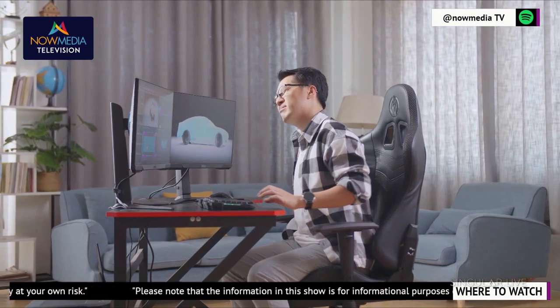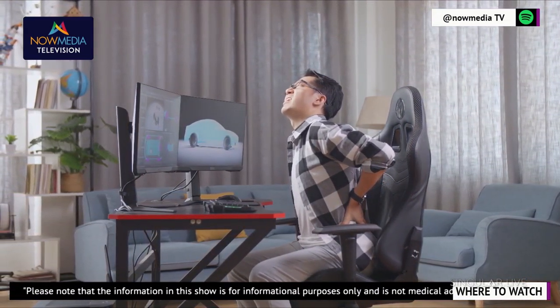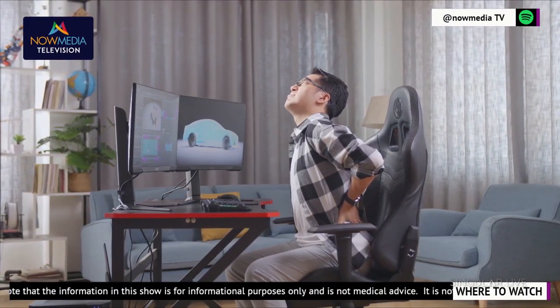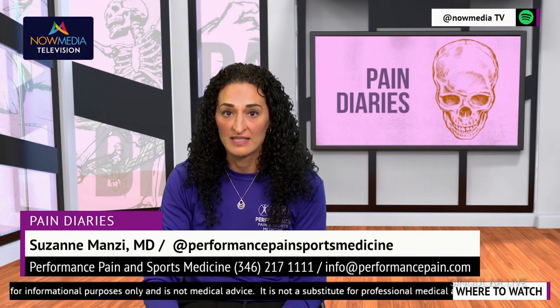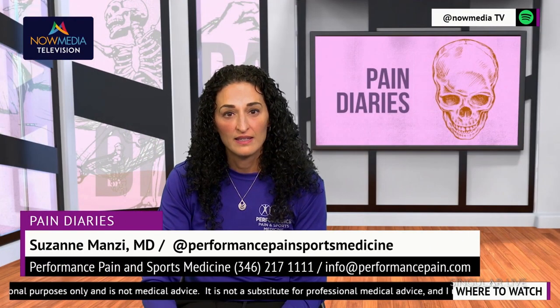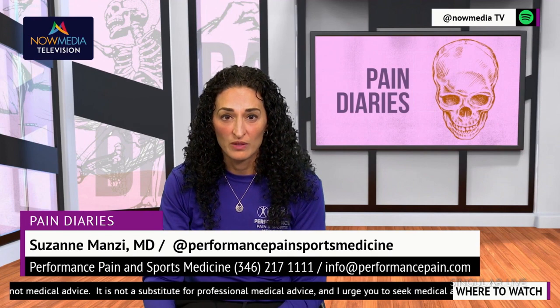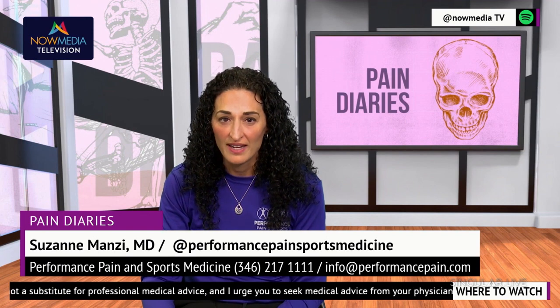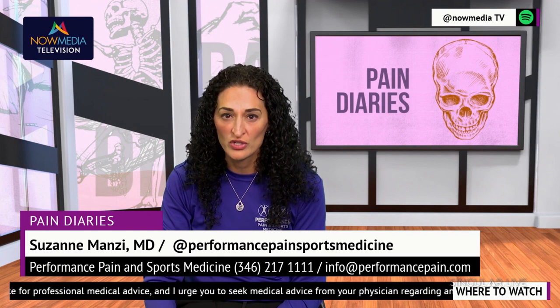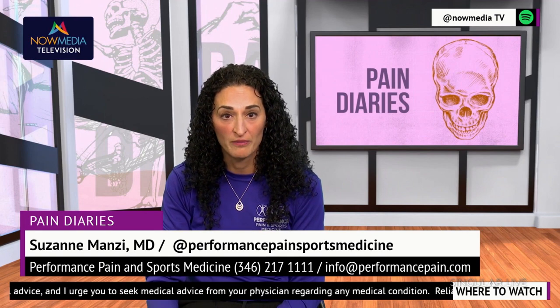People also want to know, can you still get a massage, do physical therapy, have chiropractic sessions with the Reactivate device? Well, it's important to note that no deep tissue or manipulative treatments where the leads and the battery is placed is recommended. In consultation with your treating doctor and as clinically indicated with an exercise program is also very important. I also advise, do not attempt anything new or strenuous for the first 3 months as to not influence the outcomes from Reactivate.